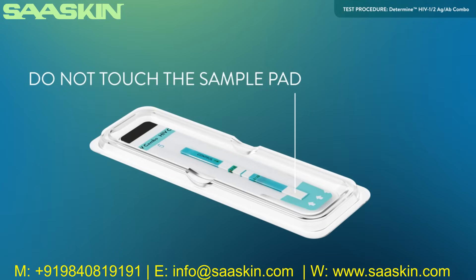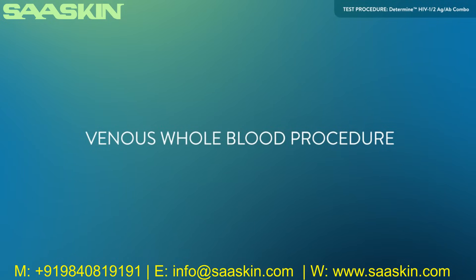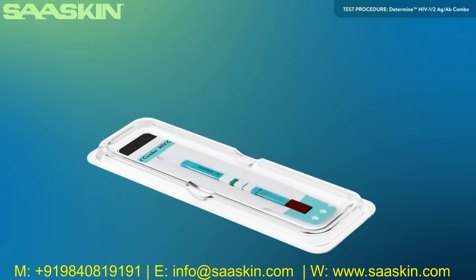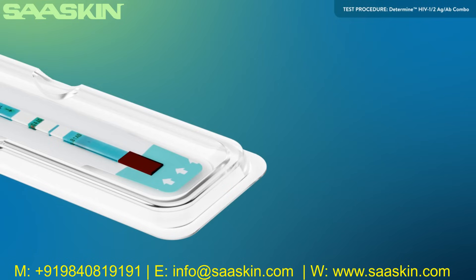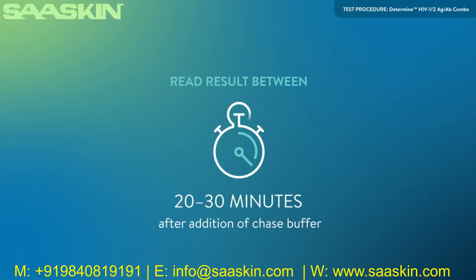Do not touch the sample pad with your fingers. Use of the disposable workstation is optional; if not used, place the test unit on a flat surface. Using a precision pipette with a disposable tip, apply 50 microliters of whole blood by touching the tip of the pipette to the sample pad marked by the arrow symbol. When all of the blood is transferred to the sample pad, wait one minute to ensure the chase buffer does not overflow the sample pad. Then add one drop of chase buffer to the sample pad. Read the test result between 20 and 30 minutes after the addition of the chase buffer. Do not read the test result after 30 minutes.